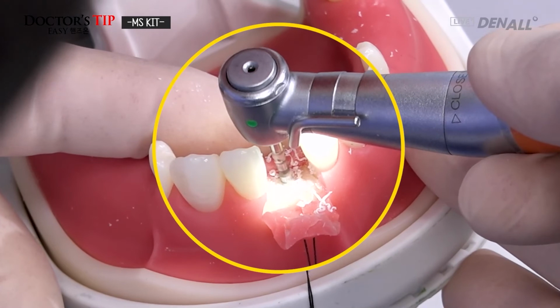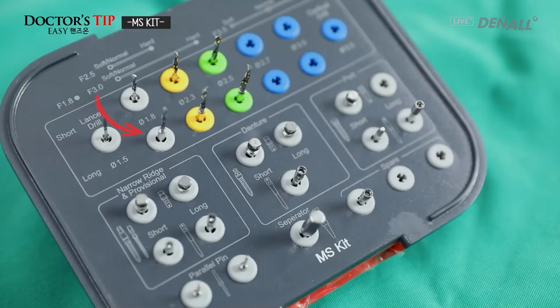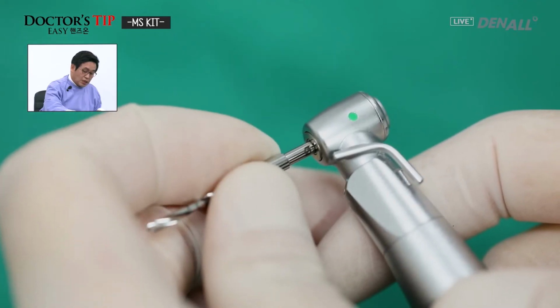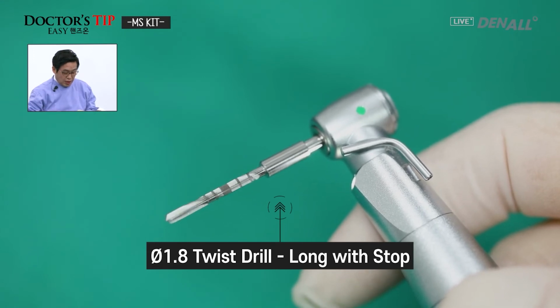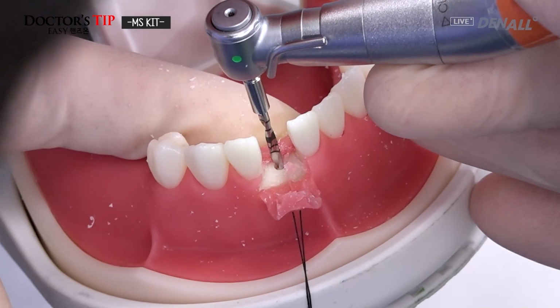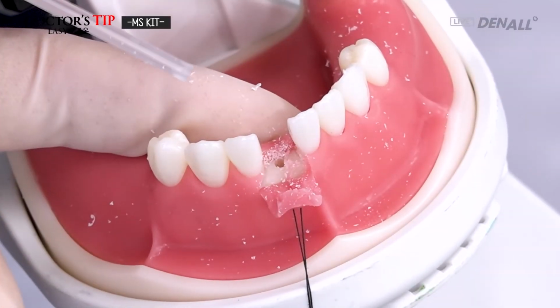If it's a short drill, then there could be interference from adjacent teeth, and if you therefore cannot go to the full length, then you change to the long type, the long shaft drill. Same diameter, use the longer version. So it's a long with stop. And again, because there could be interference in the mandibular anterior, you use the longer version of the drill, sufficient to go up to 11.5 millimeters. So I have it drilled up to that level.